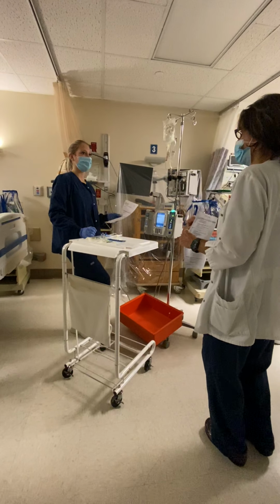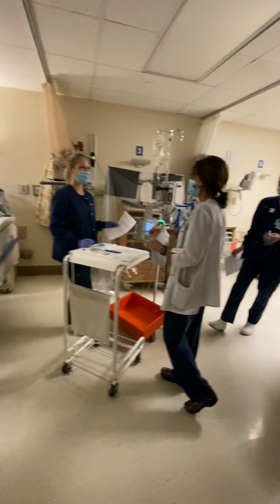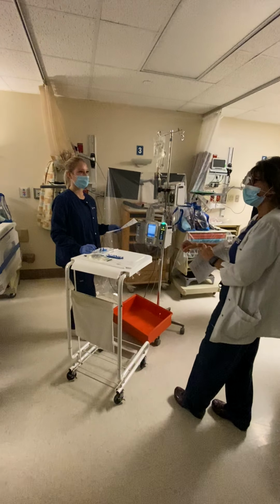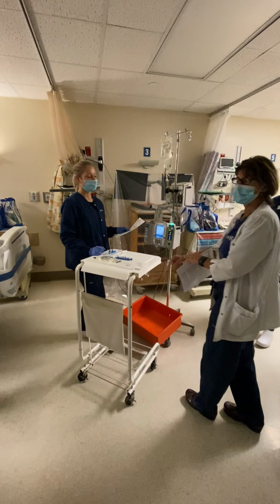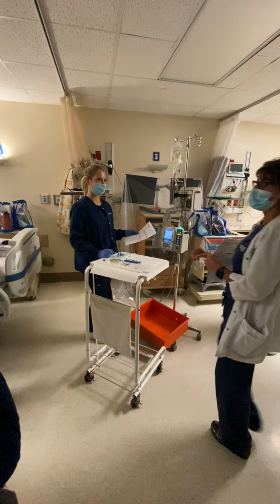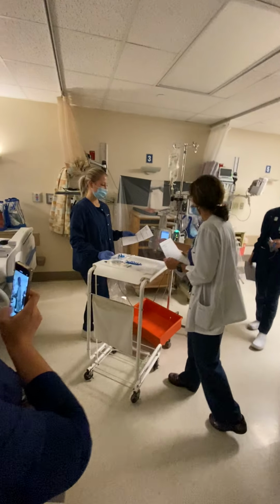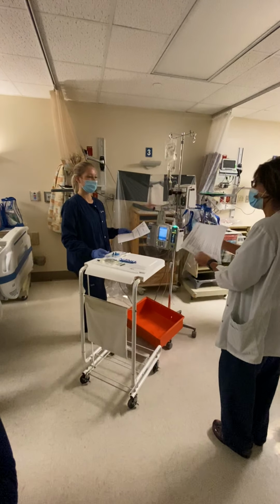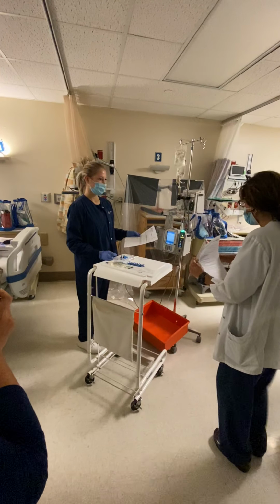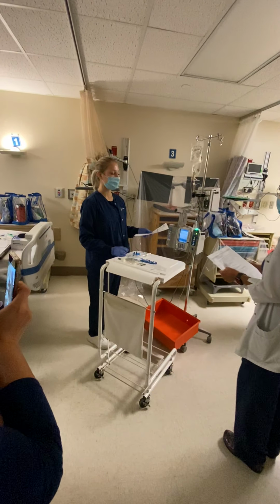And then do you ask them to verbalize their name and birthday? Yeah, I would just say, I'm checking name. I can say it as the tester, but we need to see that you're checking it against the bracelet. So check the bracelet and say, let me see your bracelet, your name is, and they'll say Susie Smith, and then you check it, and then you say, what's the birthday? And you'll say, I see the birth date is 8/28/2012, and let me read the MRN number to you, and then you read it and say, oh, that's correct, it matches the MAR, okay?